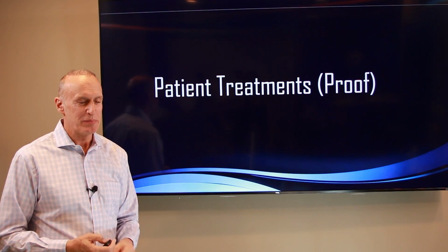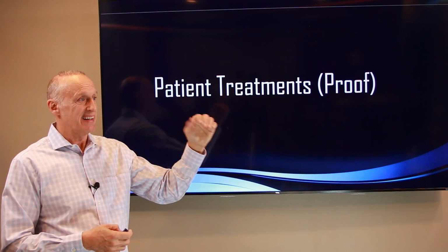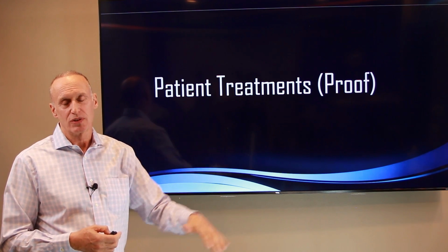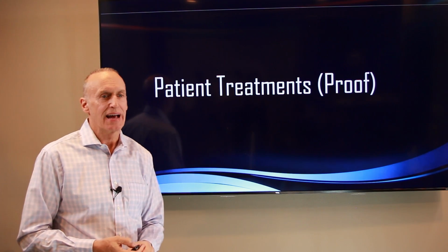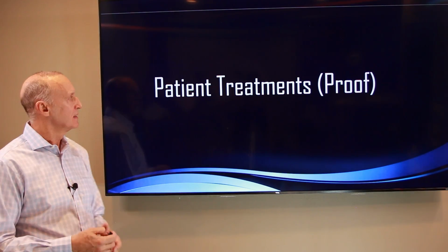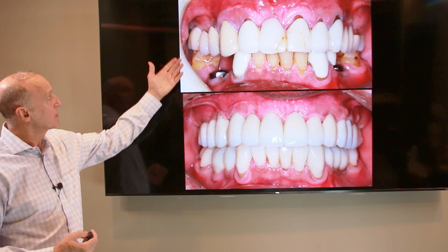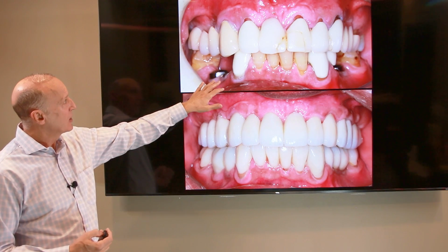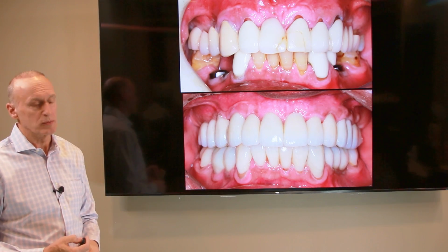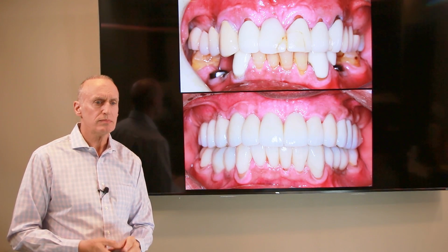Also, I've even had patients come in with a picture of somebody else's mouth and say, this is the way my mouth looks. Can I get this same result? I don't expect the gallery to be used like that, but I'm glad people are looking at it that closely. So this first patient I'll show you is a patient who came in with failing teeth. He had already had implants done at another doctor's office many, many years ago and never had them restored, which is another point I want to stop and comment on.